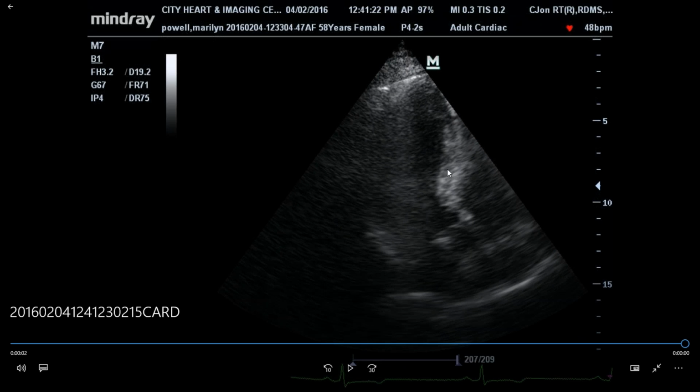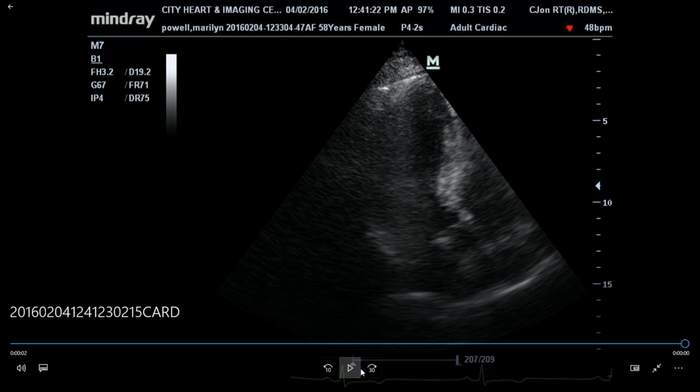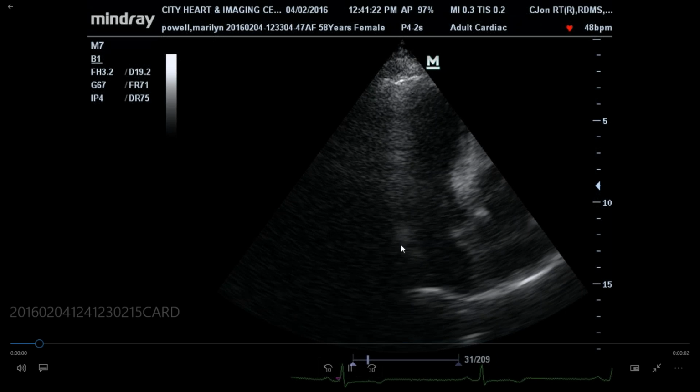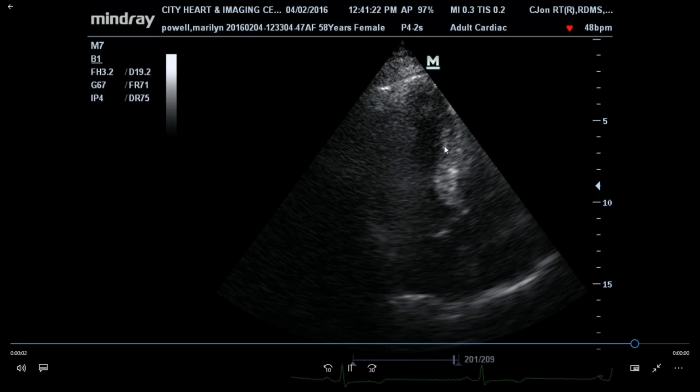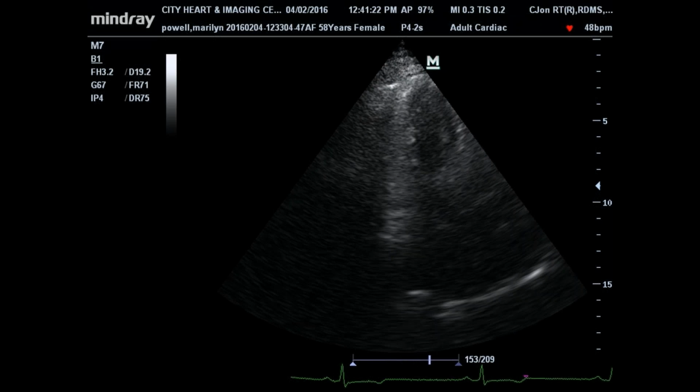This is your anterior septal wall, your aortic valve, aortic root, ascending aorta. This is your left atrium, mitral valve is right there. Apical 3-chamber view, because this is one chamber, second chamber, and this is the third chamber. Okay. Aortic valve opening and closing, mitral valve opening and closing, inferior lateral, anterior septal. So further counterclockwise rotation.